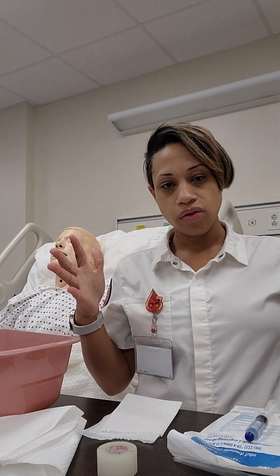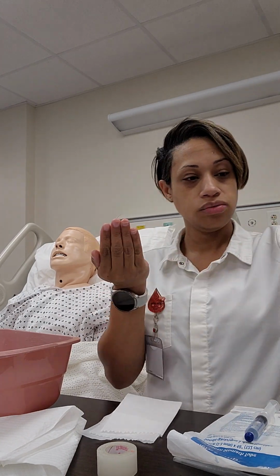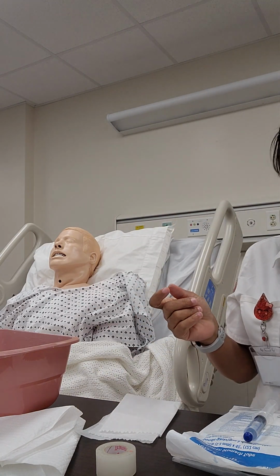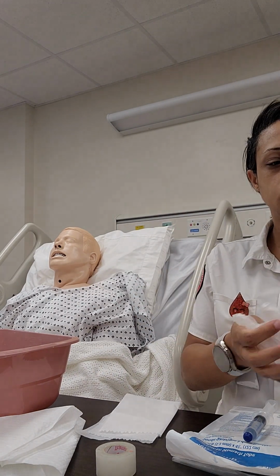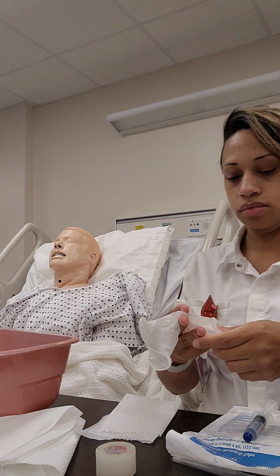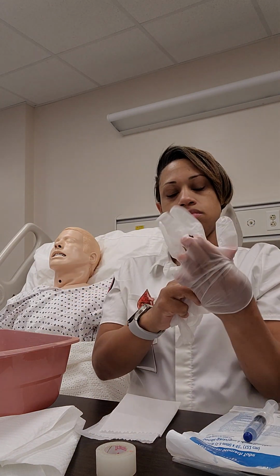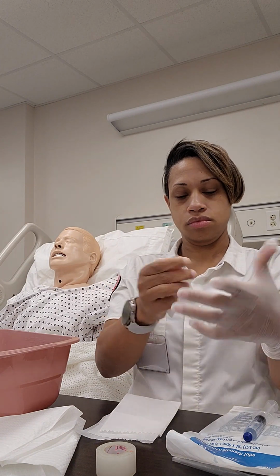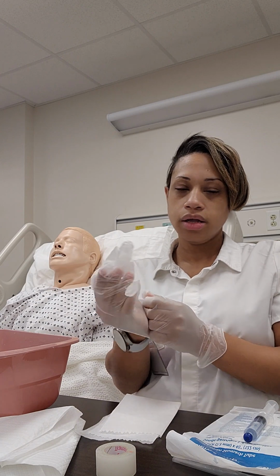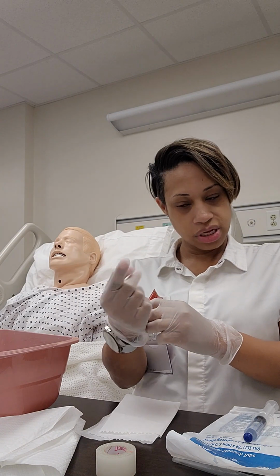Once I have gathered all of those things, I will wash my hands, and then I will put on clean gloves. Once my clean gloves are placed and on, these are small gloves.